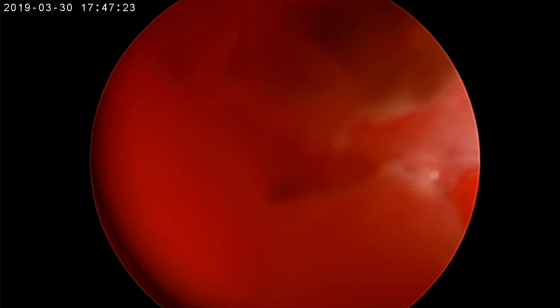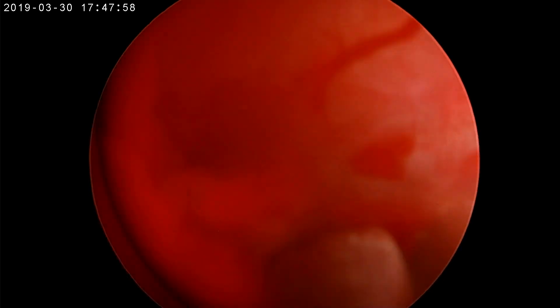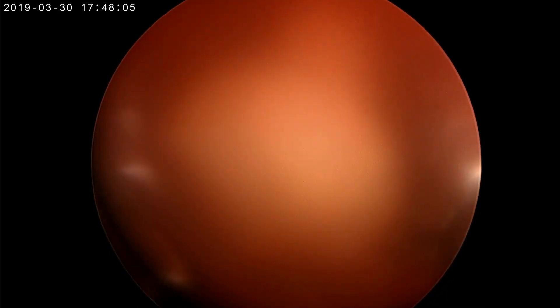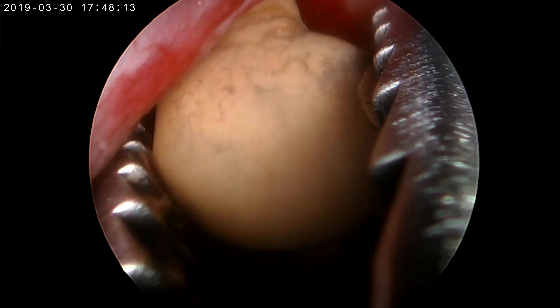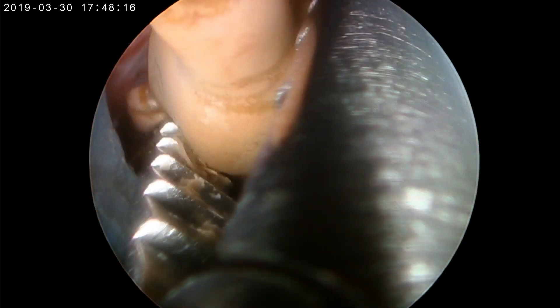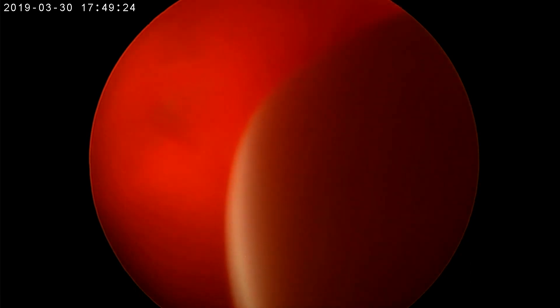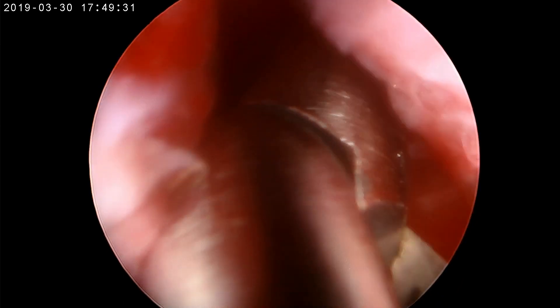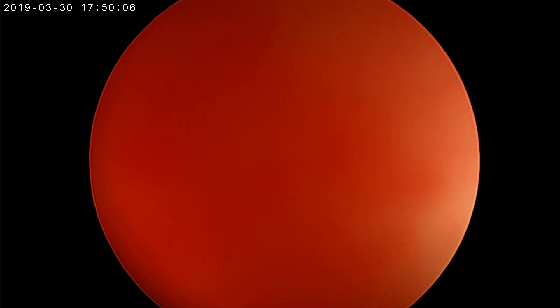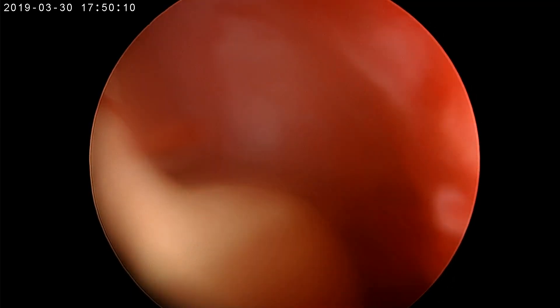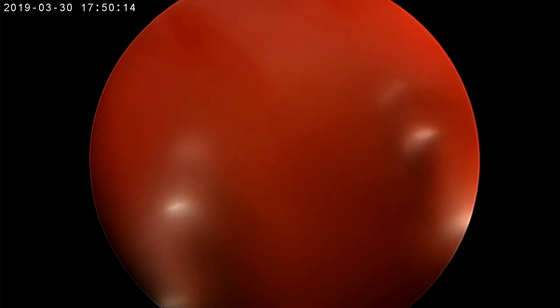Searching for the inferior posterior calyx, coming back from the inferior calyx and slowly looking for the opening of the posterior calyx to identify those stones. A small infundibular opening is seen — this is the mouth of that calyx. Using a foreign body forceps, the instrument is passed slowly into that calyx to identify and retrieve the stones one by one. This is very important: after clearing the major bulk of stones, residual stones in some calyces need to be properly identified using this orientation technique.